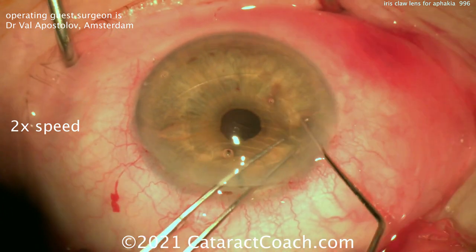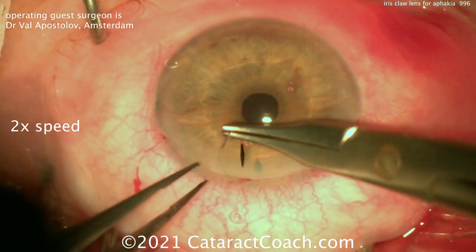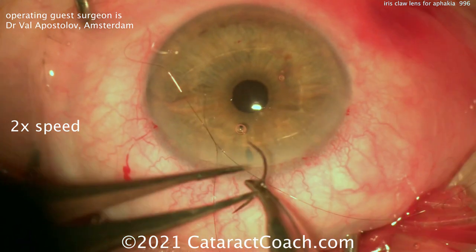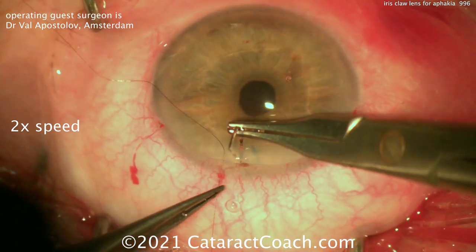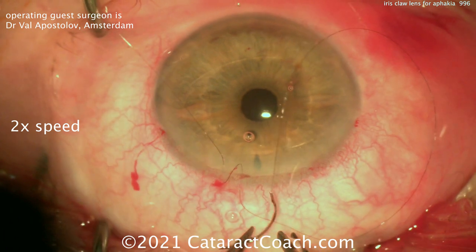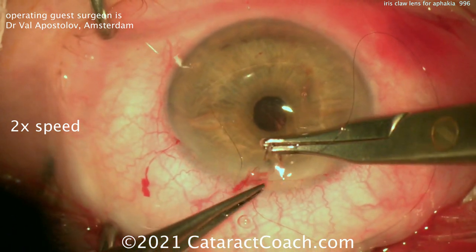If you are going to place the lens on the anterior surface of the iris versus the posterior surface, there's going to be a difference in the lens calculation. The posterior placement will require a higher IOL power for the same refractive outcome. I do trust Dr. Apostolov, and we will do it his way — with anterior placement on the anterior iris. That iris stroma is stronger and more robust, and the patient will have a better long-term outcome.